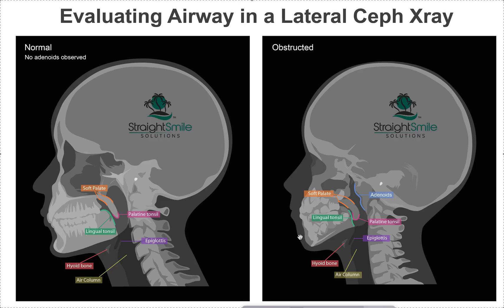You can see this is a child. The other thing we notice is that this child has a very classic SDB kind of profile — the SDB look of the face: a longer face, a steeper mandible, a downward and backwards growth instead of forward growth. Sometimes they have gonial notching. This is all very classic signs of airway issues caused by either tonsil or adenoid issues.